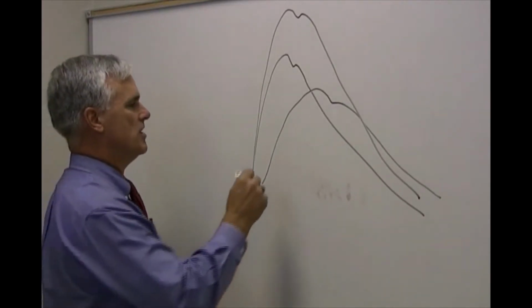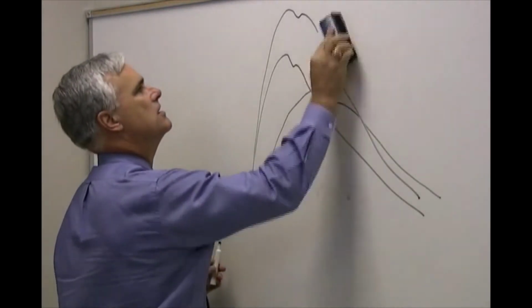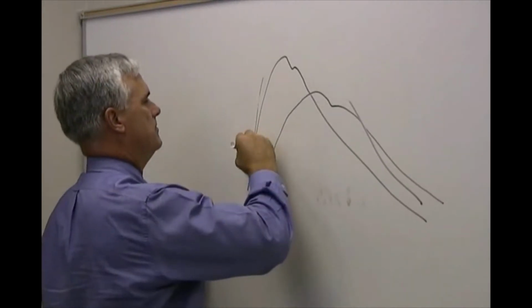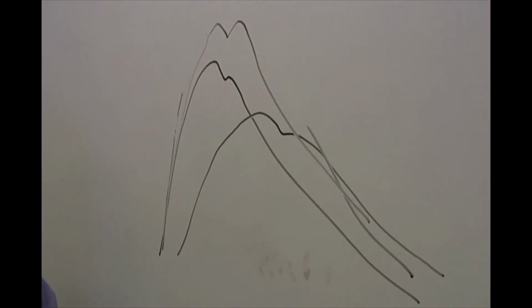Finally, there's one other pulse that you can detect on Harvey, and I'm going to have to erase the water hammer to show it to you. But this would be a bifid pulse, and it is somewhat hard to tell the difference between the water hammer and the bifid pulse because they feel similar, but I think you can get it with some practice.